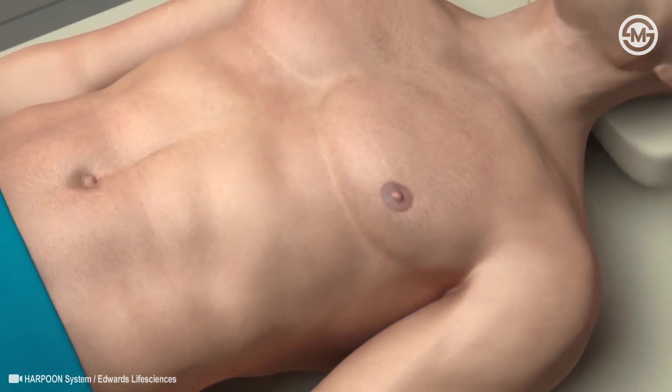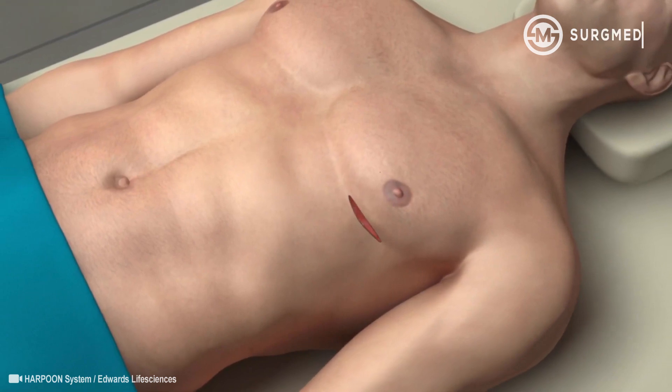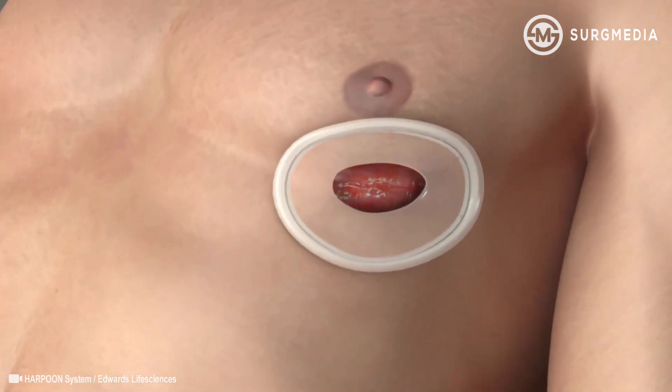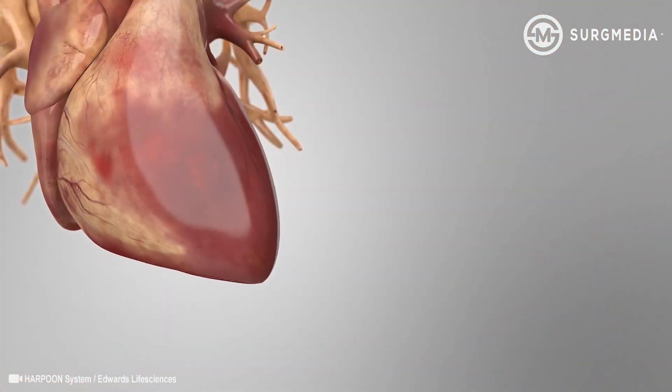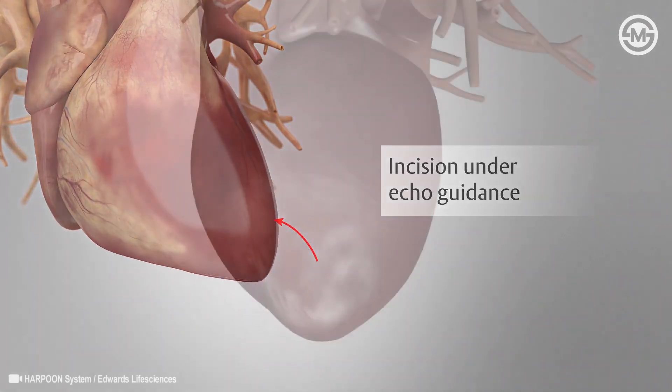Unlike open-heart surgery, the procedure is performed on a beating heart accessed through a small incision on the left side of the chest. A one- or two-inch opening is made between the ribs to access the beating heart. The incision site is near the tip of the heart and guided by ultrasound, or an echo, taken through the esophagus.